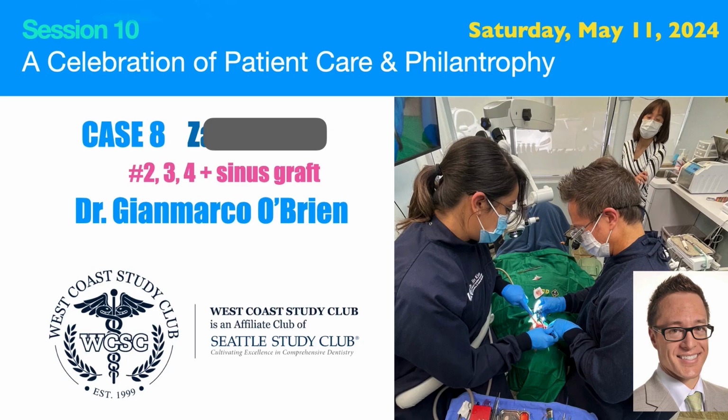This is a case that we actually did a review as a group of the actual case workup. This is a case done by Dr. Gianmarco O'Brien, our co-director, prosthodontist in-house. This is a case where we did sinus graft and simultaneous placement of 3 implants in the upper right quadrant, namely the 2 molars and the bicuspid area, which was done particularly well.